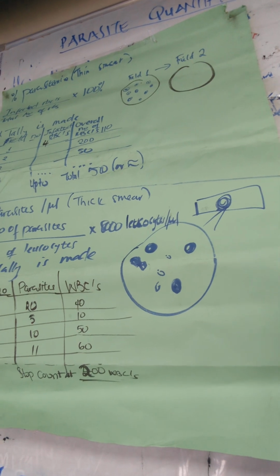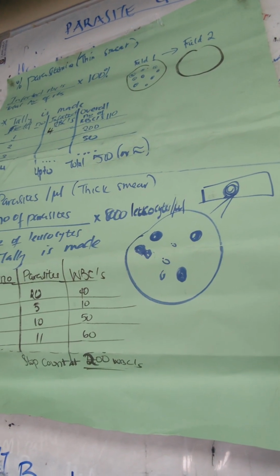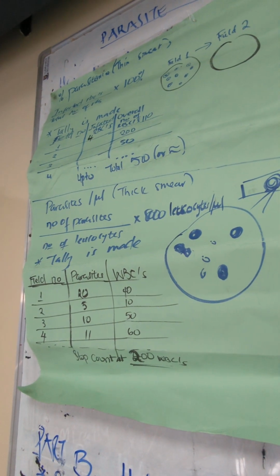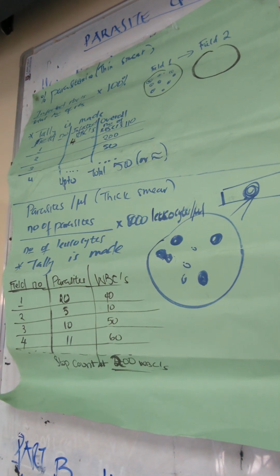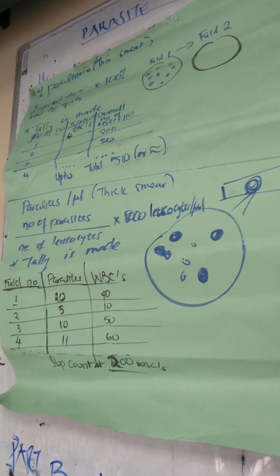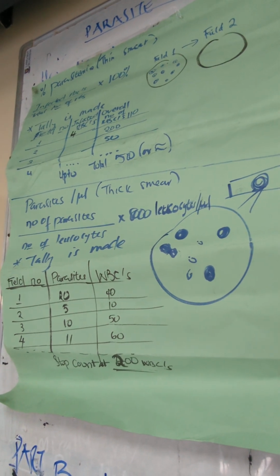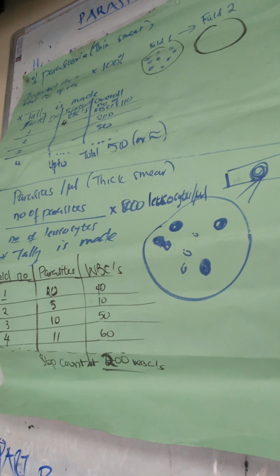Basically, the plus grading system is not as popular, like I said, in the lab, but it's still relevant. So you can go through and study it, and see what it means when you hear you have a +1 malaria, you have a +2 malaria, and so on. But that whole grading system is generated from a thick smear.